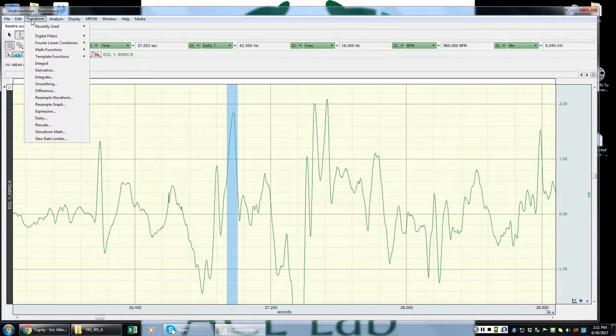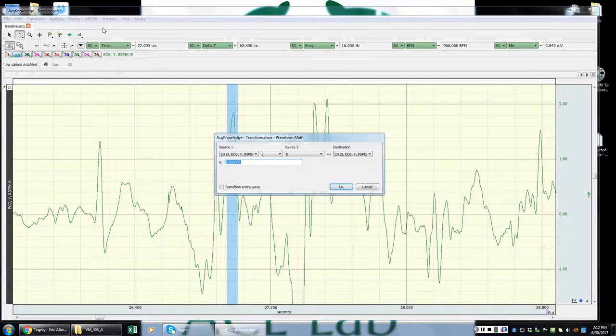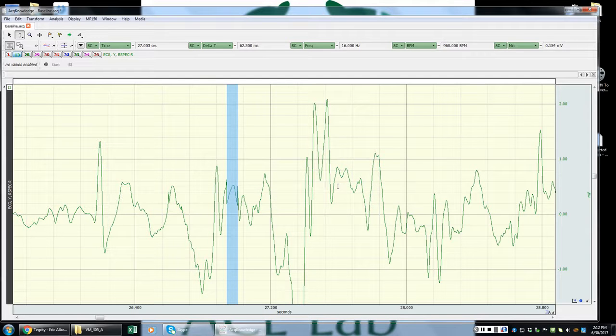Transform. Now I can go to recently used, waveform math, and then do the same thing. Now this peak was a little bit taller than this one, so I might even try like 3.5. Click OK. Okay, so now you see that that wave drops down considerably.